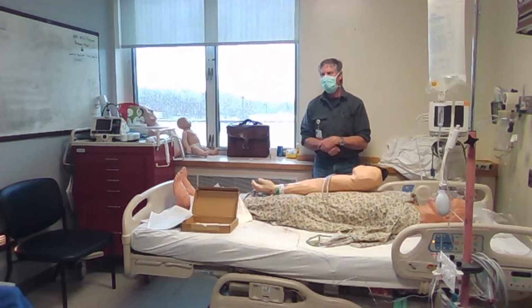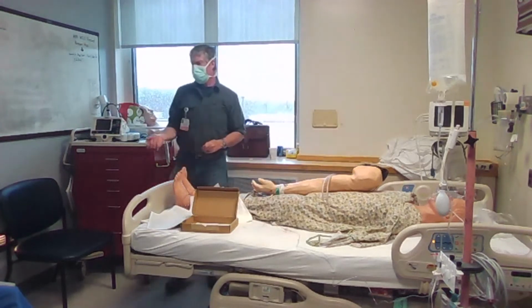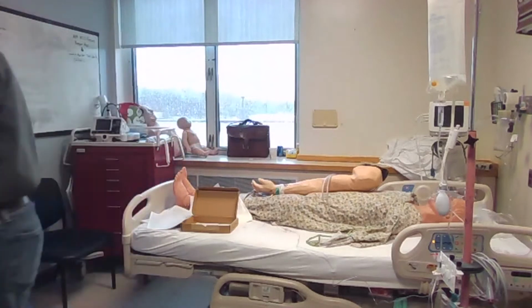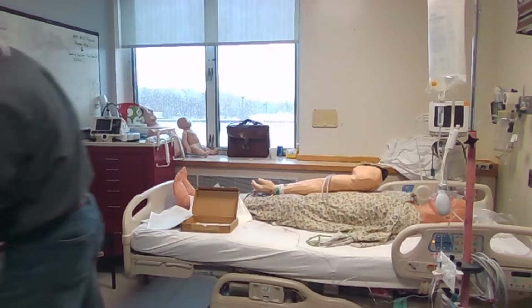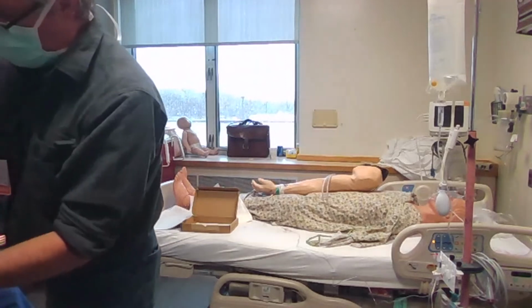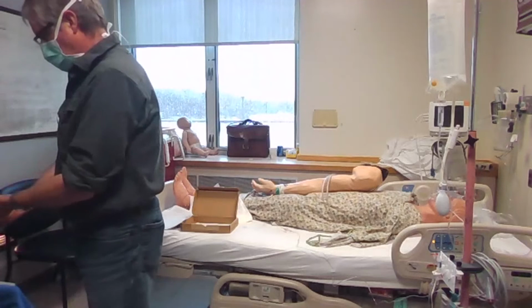What is this thing for? It's the same as on regular IVs, the StatLock. It goes the same way, but it goes over like this. So this will come off. Put it right here, in the little indentation, and then you can suture it to the skin like that.